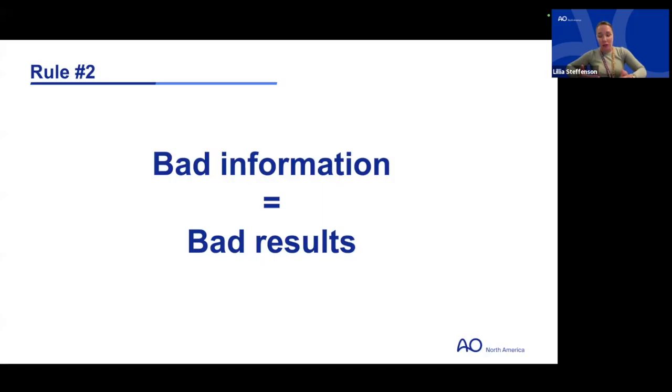So understanding what makes something a good or correct image is critical in order to be able to get the information that you want. Because if you have a poorly rotated film or just an inadequate view, you really can't make any type of diagnostic conclusion from it.